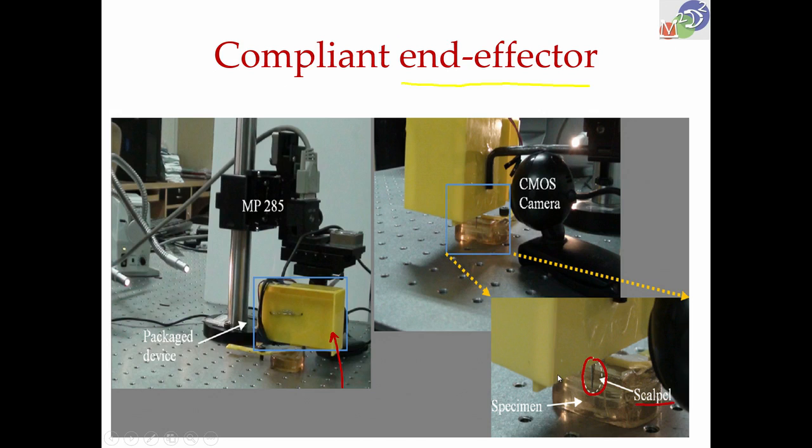It is attached to a compliant mechanism that we will discuss, and there is a CMOS camera that looks at the displacement of this scalpel, and based on that we estimate the force. Knowing the force, the user can cut or not in the teleoperation, but more than that there is an upper threshold on this. When the cutting force exceeds that value, the scalpel will simply retract.